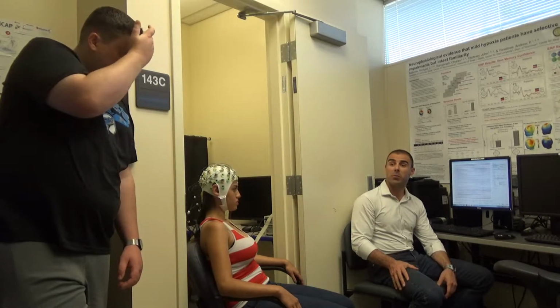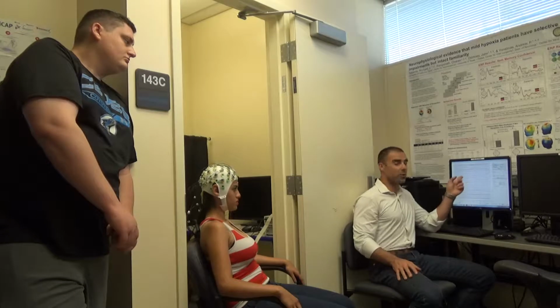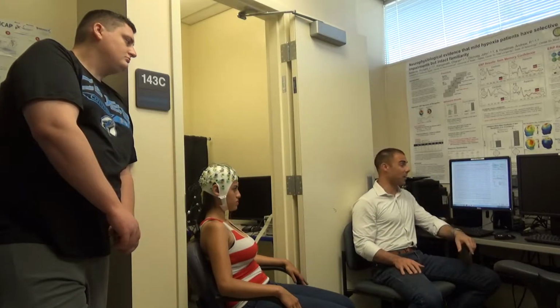It's okay if a couple ones sneak in, but you want to really coach them up and give them that feedback. That's kind of what neurofeedback is. You could have people who might have different types of psychopathology. Say depression is a type of psychopathology that is very commonly approached with neurofeedback. And then you might have clinical situations like strokes that people might be recovering from, where they also use neurofeedback. You can connect people to EEG, and they can observe their own neurophysiology, just like Nelly is now.